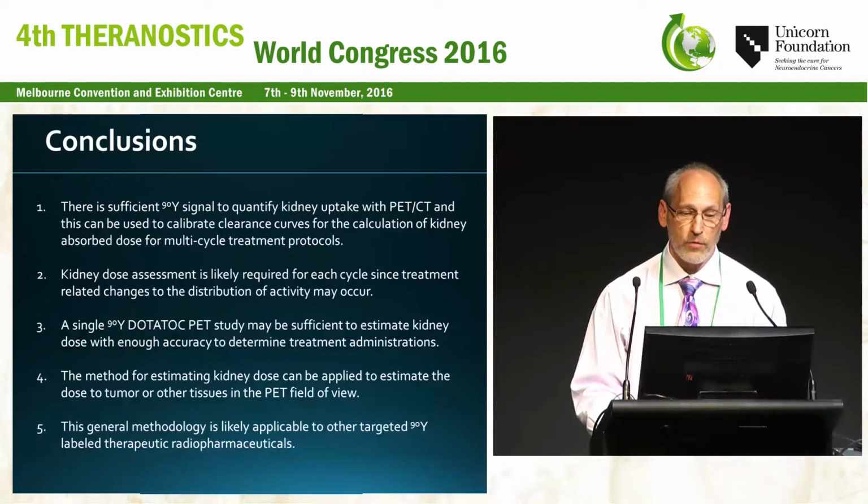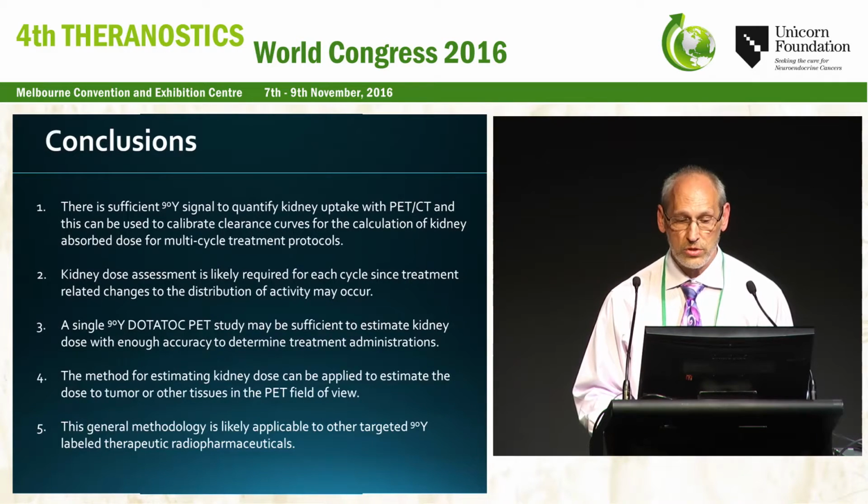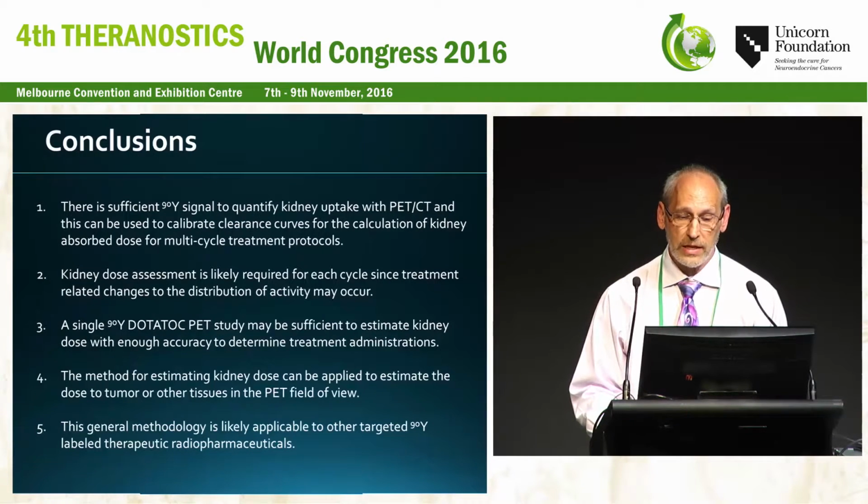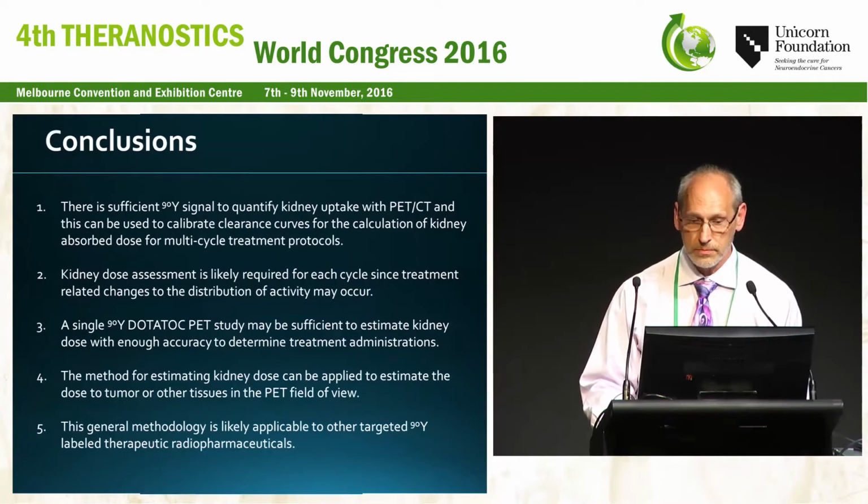Fourthly, the method for estimating kidney dose can be applied to tumor dose if we're lucky enough to have it in the field of view. And lastly, and perhaps most importantly, this is a general methodology. It's likely applicable to other targeted yttrium-90 labeled therapeutic pharmaceuticals. Thank you very much.